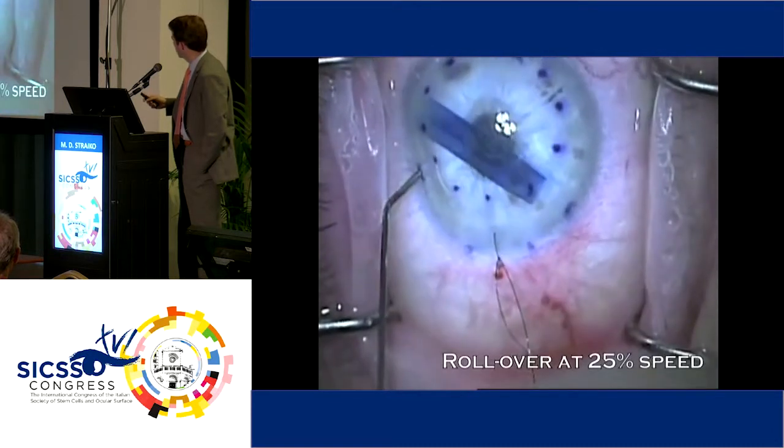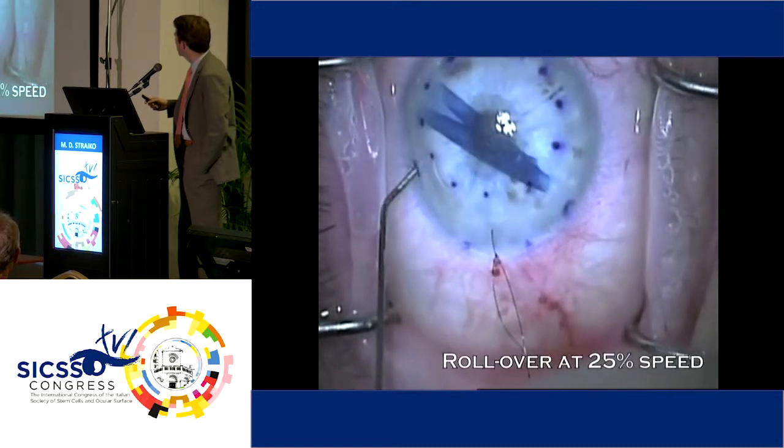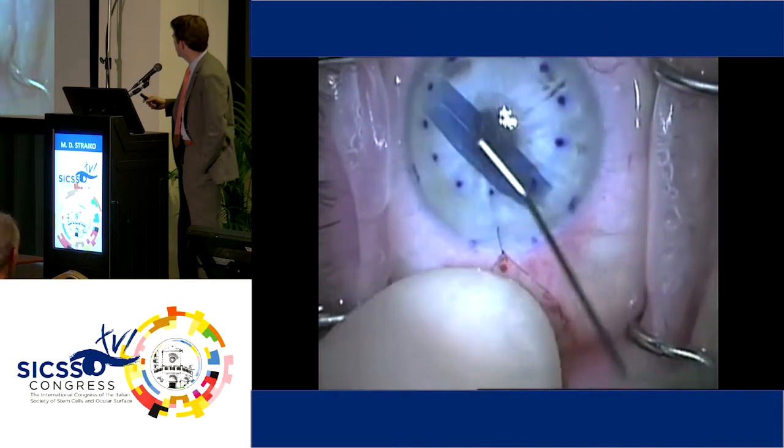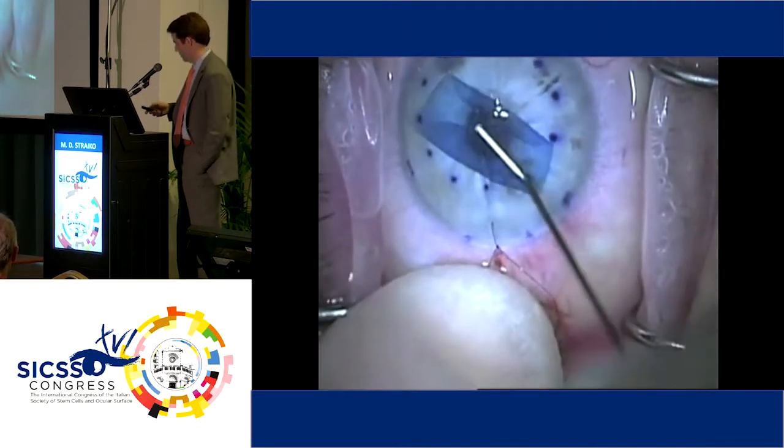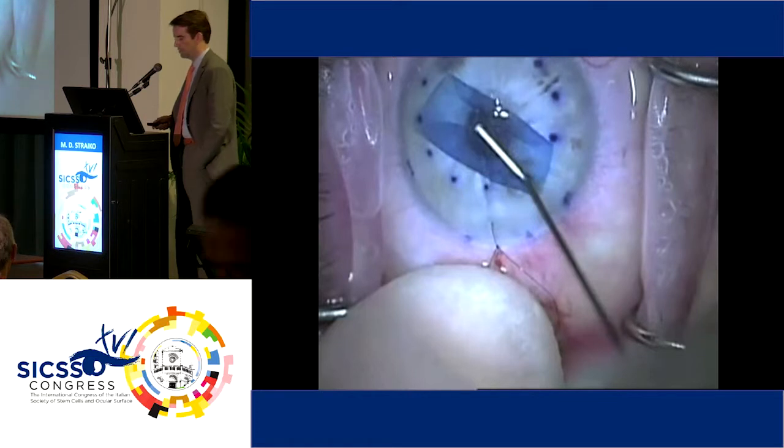It flips it over, and I'll show that again in slow motion. And it just rolls the graft over. Now, if I had injected straight at the graft, it would have just pinned the graft into the angle. And now it proceeds as a normal case.